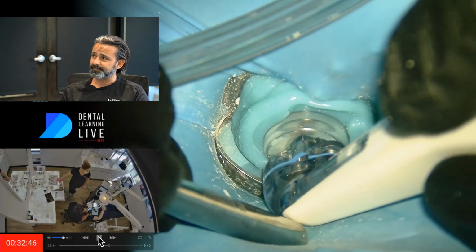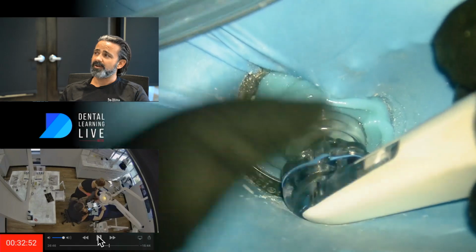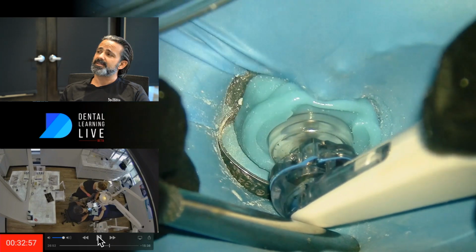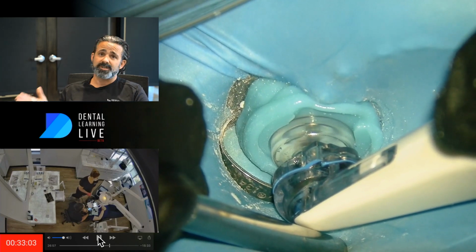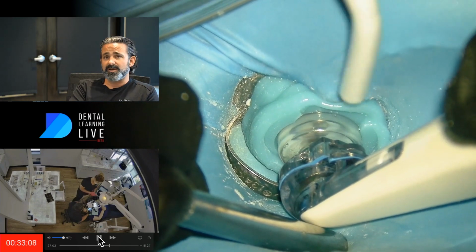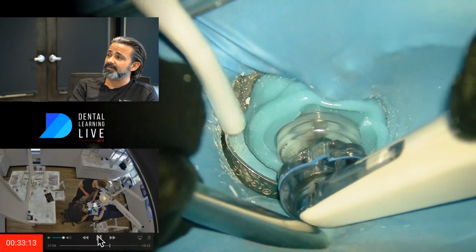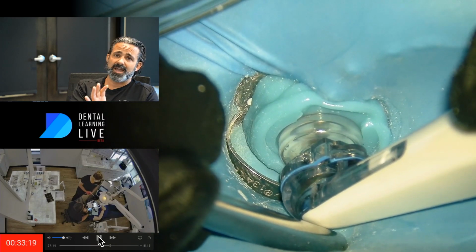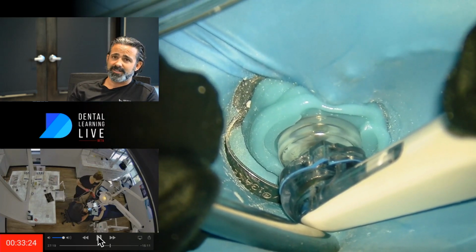It's very good. So getting a little bit of pooling now. Frankly, that can be for a lot of reasons, but for me it's actually just position. Sometimes when you see that, especially in a case like this where we're re-accessing the same crown, and that crown pre-existed the previous root canal, you could be washing out some of the seal of the crown, which is a good thing, because it should get replaced in that situation. But this is just me looking around the room and not having things lined up in that kind of tight environment. So I put my mirror handle back on and just re-corrected myself.